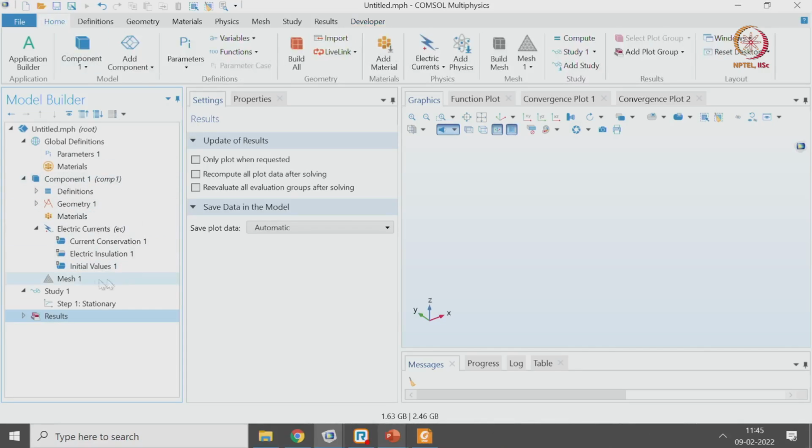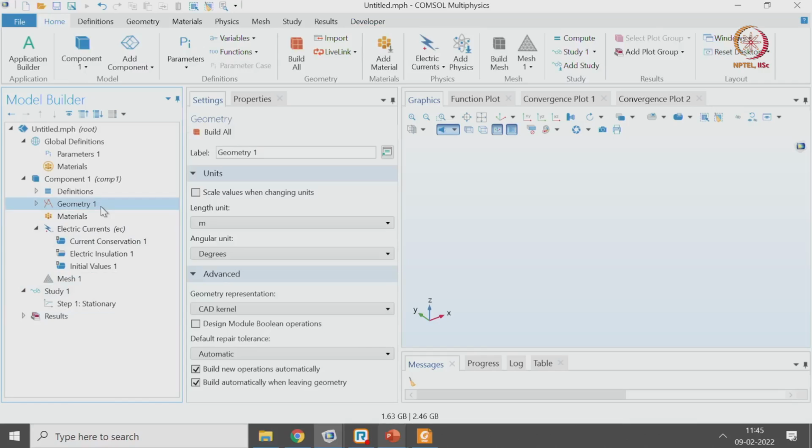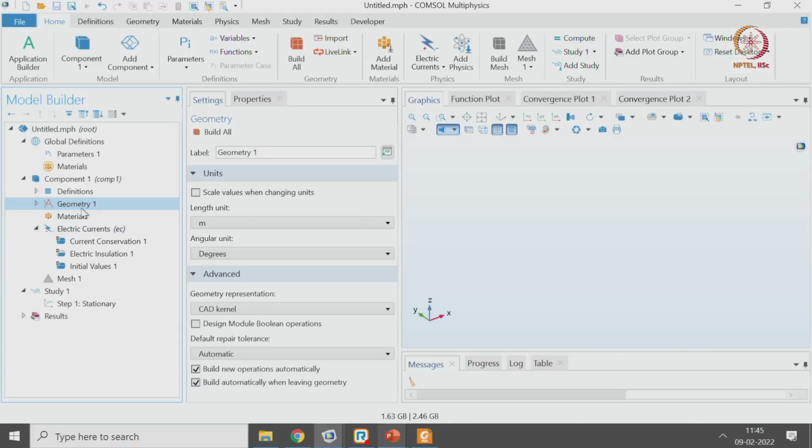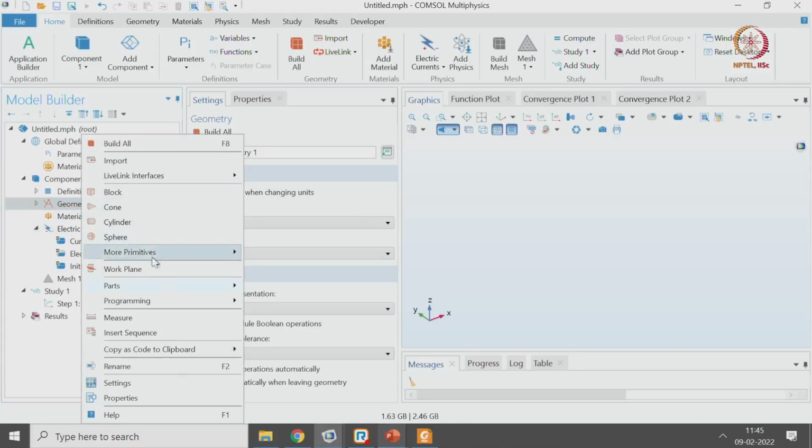Okay. So with that, let us begin and build this model. The first thing is to create the geometry, as you can see over here. To save time, I have already created it, and I can just insert that sequence within this model.